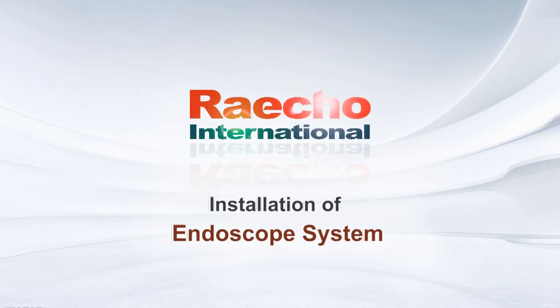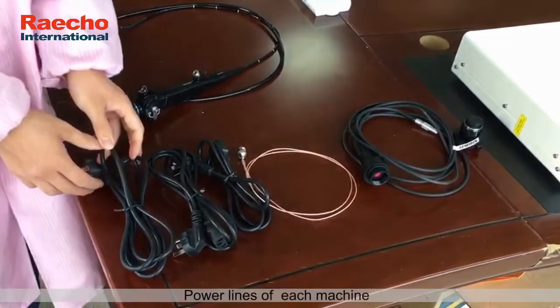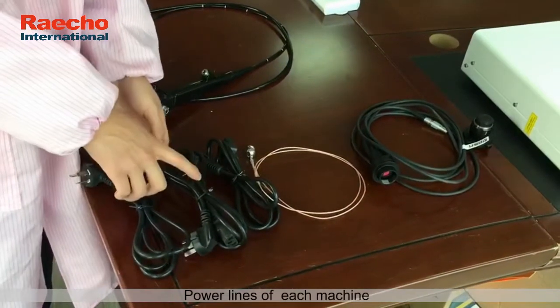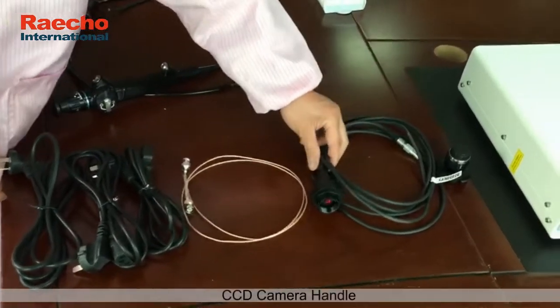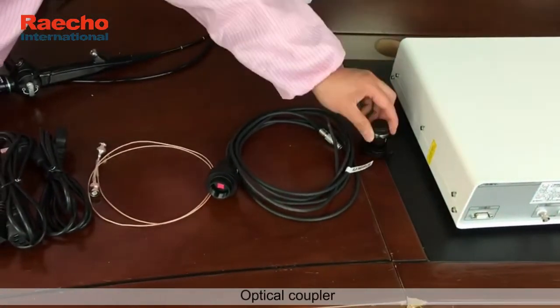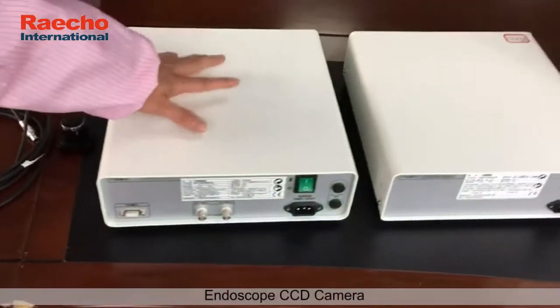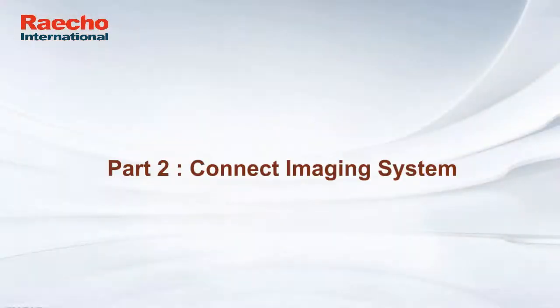Raecho installation of endoscope system. Part 1: accessories introduction. Power lines of each machine, signal line, CCD camera handle, optical coupler, endoscope, CCD camera, cold light source, endoscope monitor. Part 2: connect imaging system.